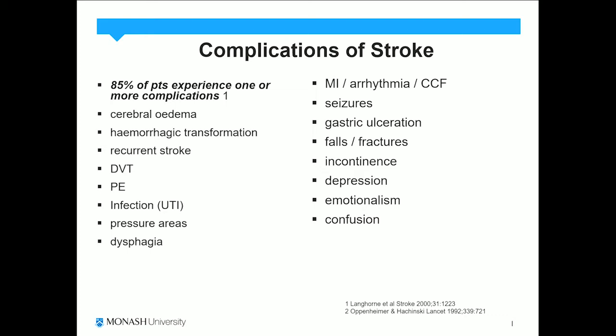So for radiology, it's really key to try and scan this patient as soon as possible so that treatment can start as soon as possible to minimize some of the complications for the patient.